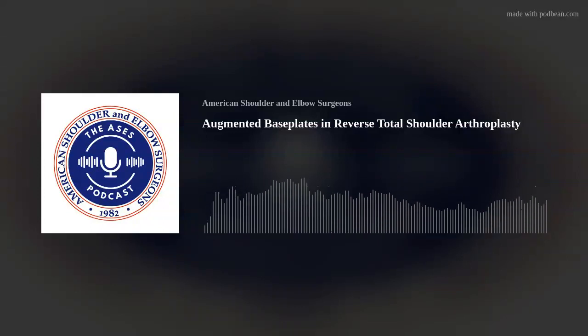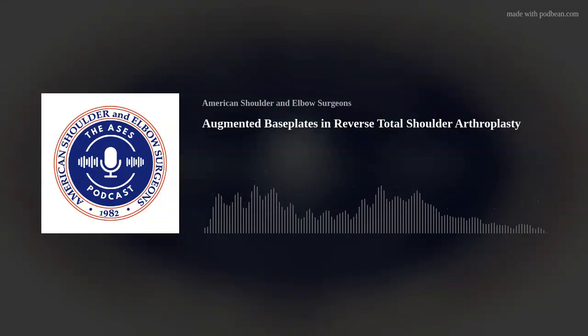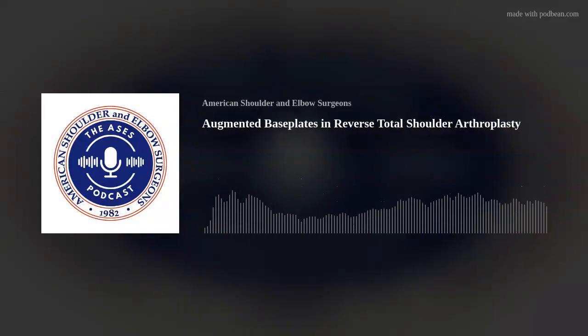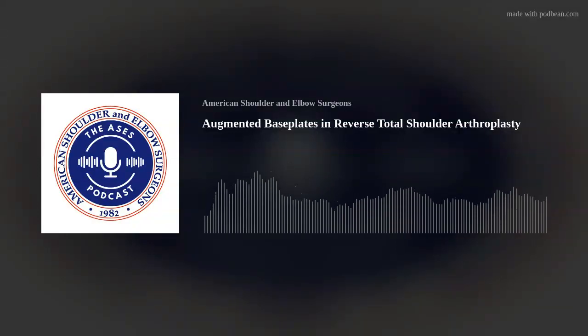If I can make a comment about version and inclination, in terms of retroversion, I agree with Joe. I don't think version matters that much. If you look at the literature, you probably get the best impingement free range of motion at neutral version. But if you look at some clinical papers, they pretty much show that whether it's the alternate center line, which is anteverted, or we have a paper that's greater than 15 degrees retroverted, it really doesn't seem to affect clinical outcomes. So I think version doesn't matter as much.